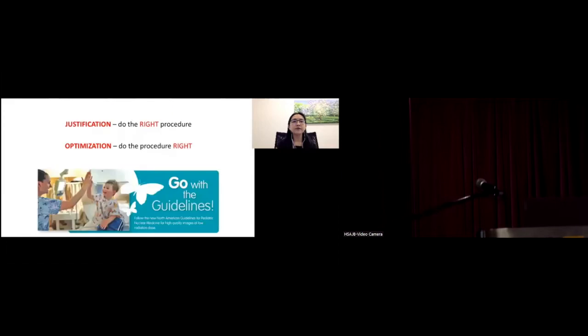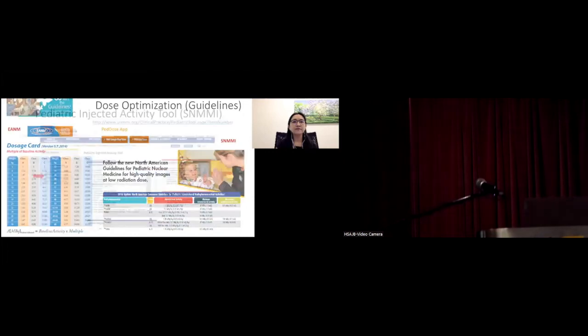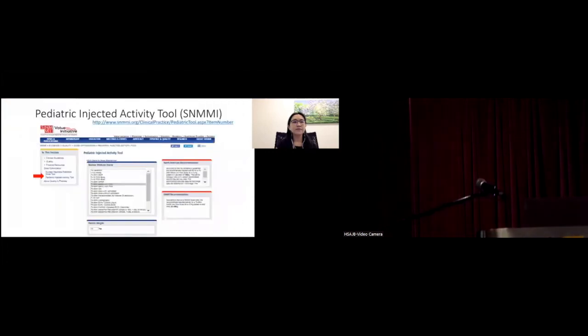Go with the guideline. We have to make sure that for everything we do, the procedure is justified and we have to optimize it. So we do the procedure right. Just showing the dose card, the web-based pediatric injected activity tool.